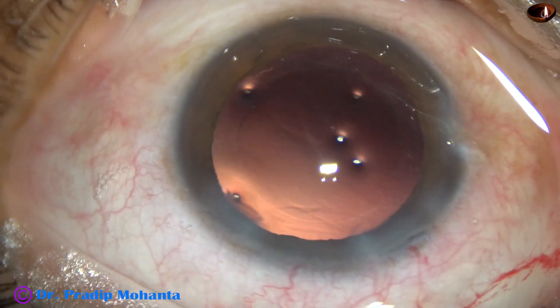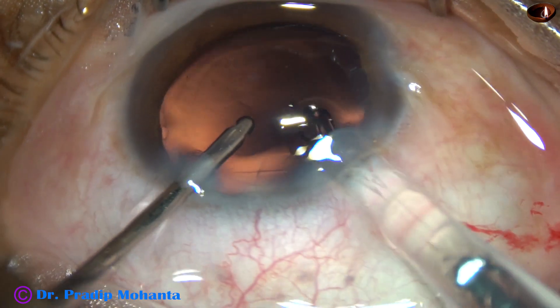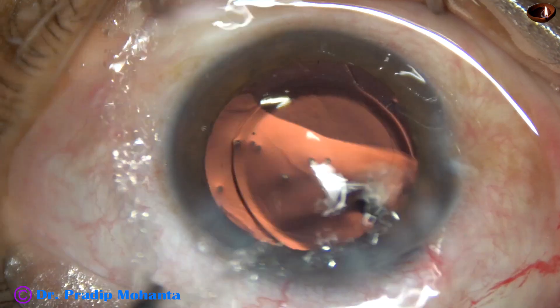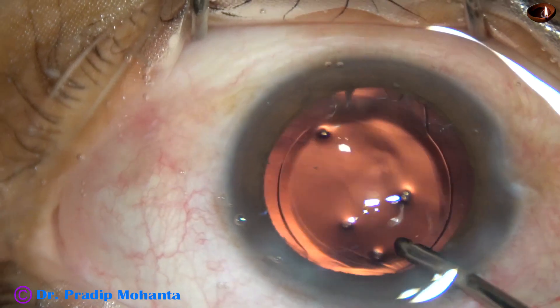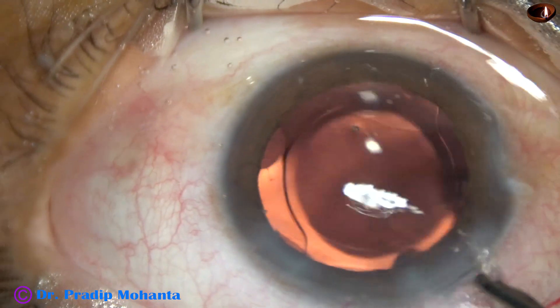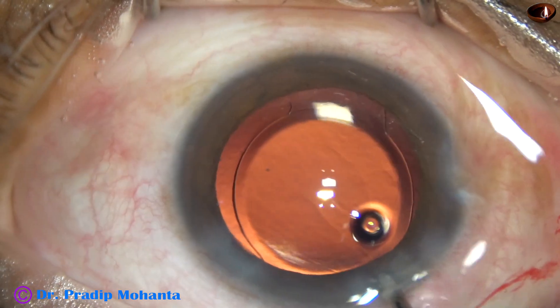A hydrophilic acrylic single-piece monofocal intraocular lens is being implanted, keeping the anterior chamber formed by the irrigating probe. The irrigating probe dials the lens. And then suddenly, a piece of nucleus comes from behind the iris and is moving in the anterior chamber.